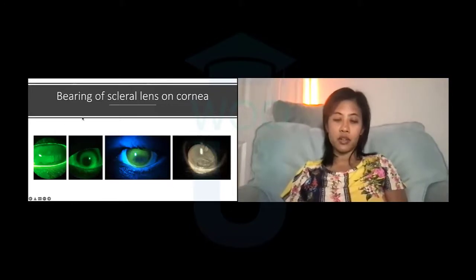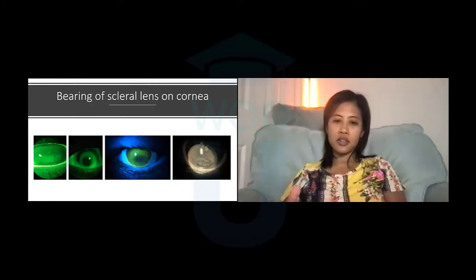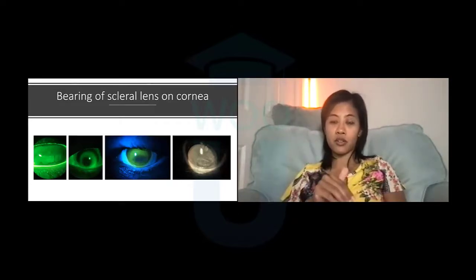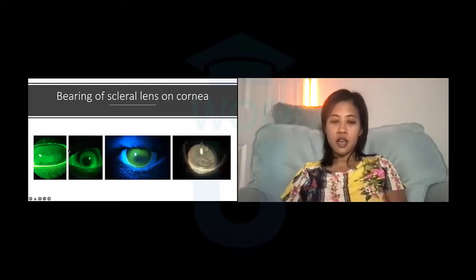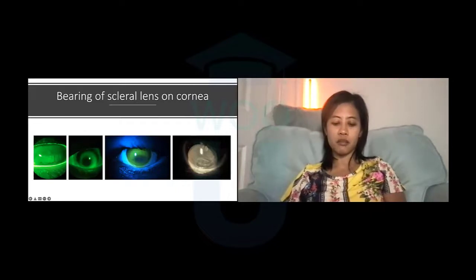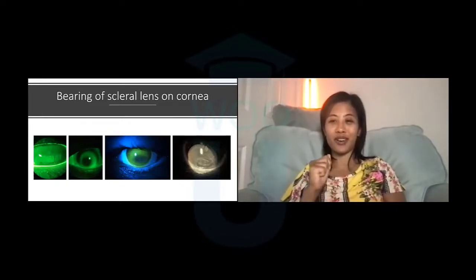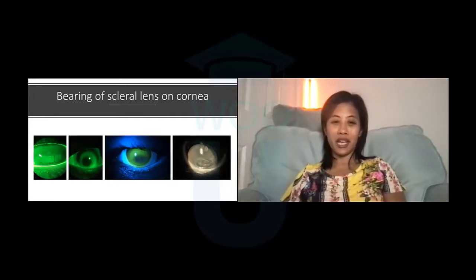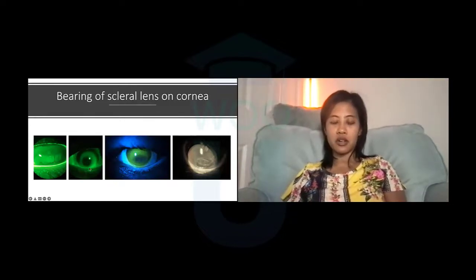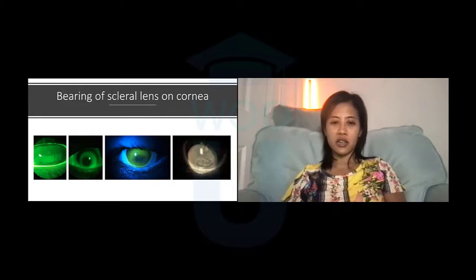You can also have bearing on the cornea when looking at the chamber. Light touches or feather touch is fine, distributing weight between the cornea and the scleroconjunctival shape. But you don't want frank bearing where the majority of weight is on the cornea — when you remove the lens, you can get epithelial erosion or frank abrasion. Your keratoconic patients are some of your most rewarding patients, but they will not complain because they don't want to be taken out of the lenses. On a full scleral lens, no weight — you want to put most of the weight on the scleroconjunctival shape.